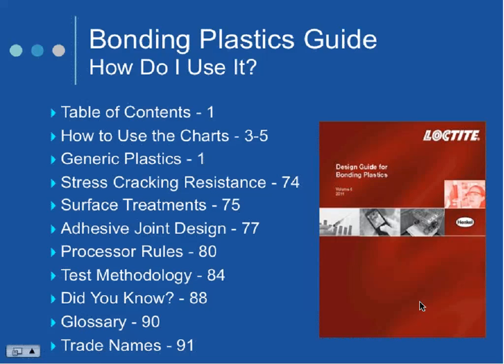Page 75, directly across from it, is kind of an interesting guide. You'll find definitions for plasma treatment, corona discharge, and some others that I have never run into in the marketplace, such as iodine treatment. Maybe you've heard of that. And on the next page, there's some more, like sodium treatment, which is commonly used in Teflon-based materials. You'll find the description of what that method is, and it'll actually tell you the types of materials it's used for. So it just gives you some options of, okay, if I work with fluoropolymers, for example, I'm probably going to have to do something to them to get the adhesion where I want it.